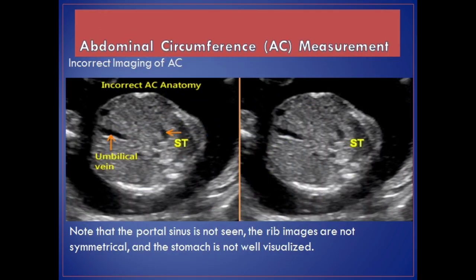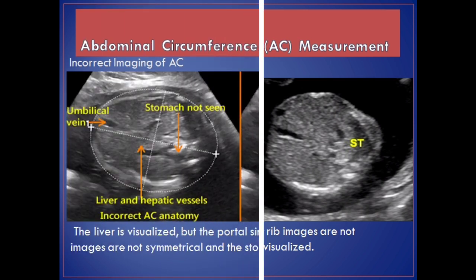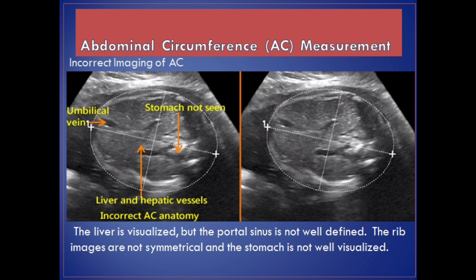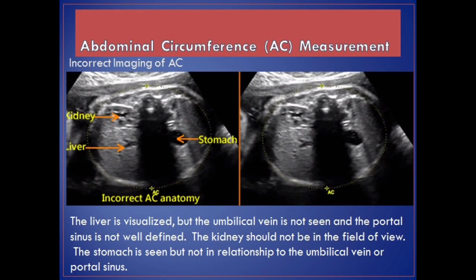Incorrect imaging of AC. Note that the portal sinus is not seen, the rib images are not symmetrical, and the stomach is not well visualized. The liver is visualized but the portal sinus is not well defined. In another example, the umbilical vein is not seen and the portal sinus is not well defined. The kidney should not be in the field of view. The stomach is seen but not in relationship to the umbilical vein or portal sinus.